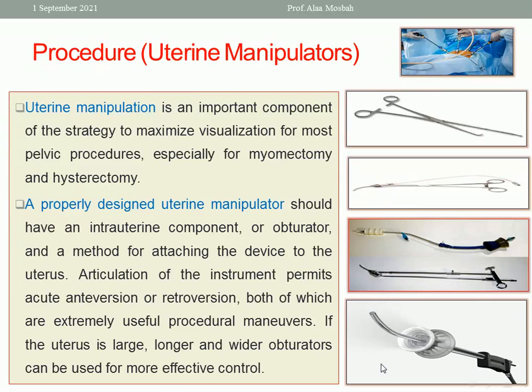Another manipulator here. So the idea of the manipulator is to move the uterus to AVF or RVF or to one side. The assistant will move the uterus to one side or to AVF or RVF, to help you while you are doing the operation, especially the surgical one.